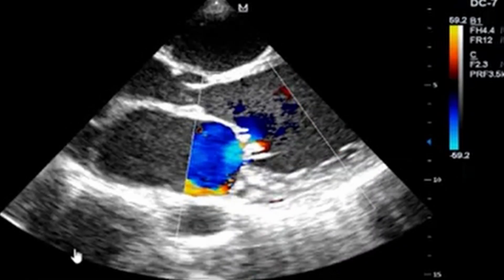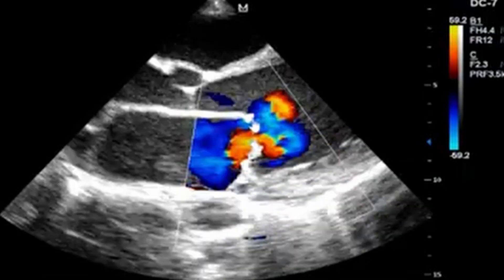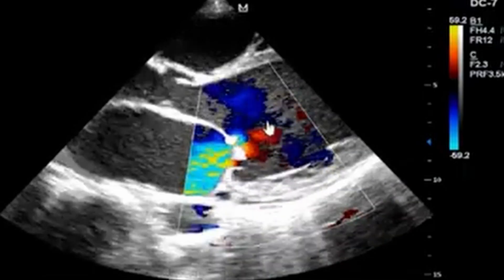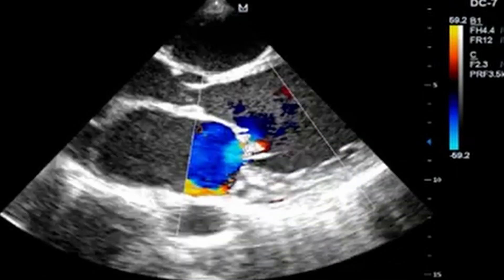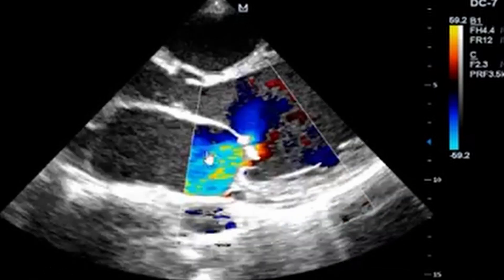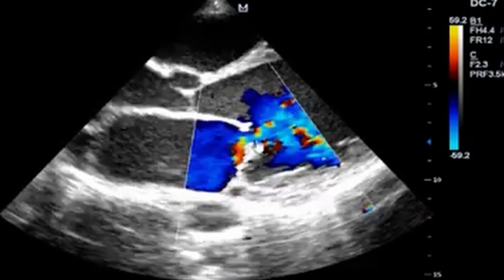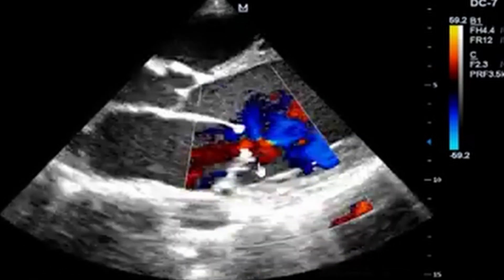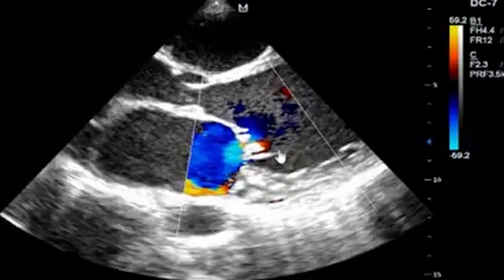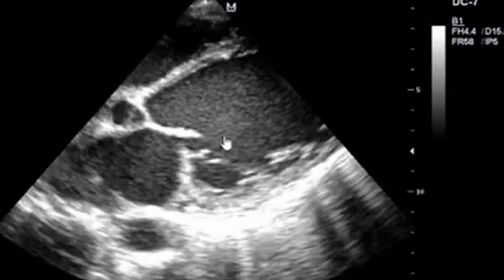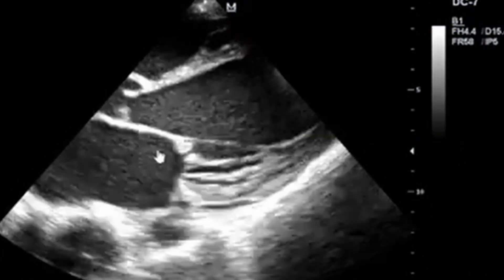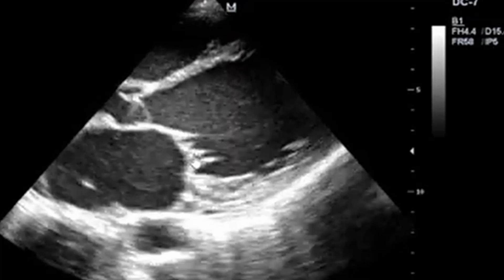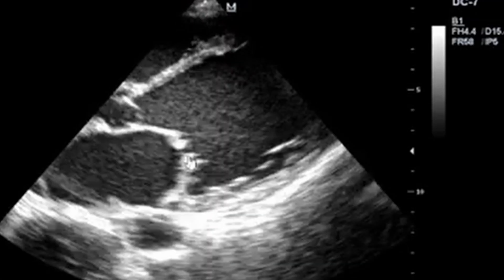The mitral valve is stenosed due to calcification, and you can see there is severe regurgitation again. You can appreciate doming here and you can see the calcifications on the leaflets of the mitral valve.